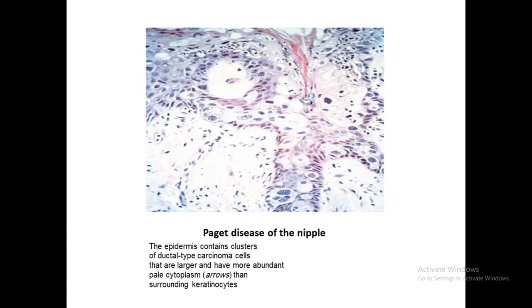This is Paget disease of the nipple. Paget disease is an expression of an underlying carcinoma of the breast, and it will definitely be of in situ ductal carcinoma type with or without invasion. Here we have the Paget cells, which are large cells in the nipple containing large irregular hyperchromatic nuclei with clear cytoplasm. These are Paget cells. This is Paget disease of the nipple.